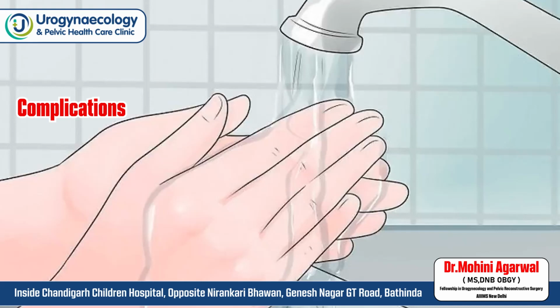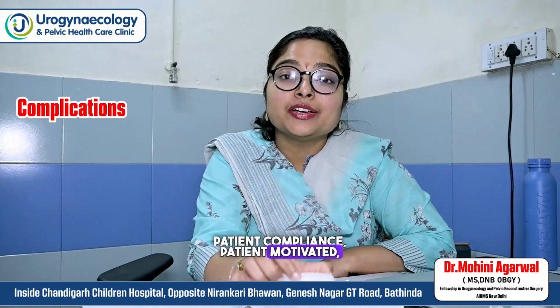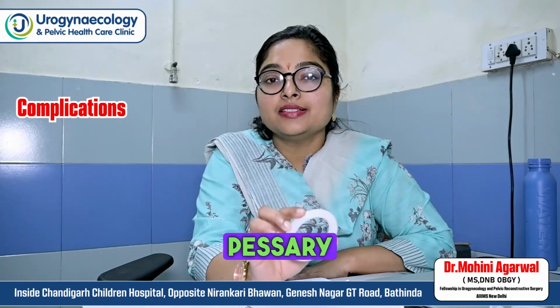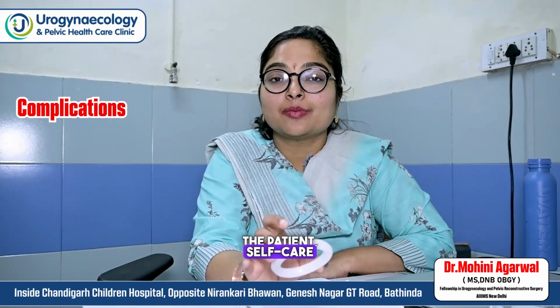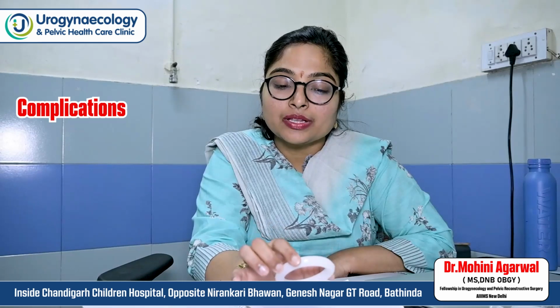Remove the pessary, wash it and then replace it. So that's why patient compliance, a motivated patient, is very important for pessary insertion. The patient needs to be educated about self-care of the pessary. Okay, this is the thing.